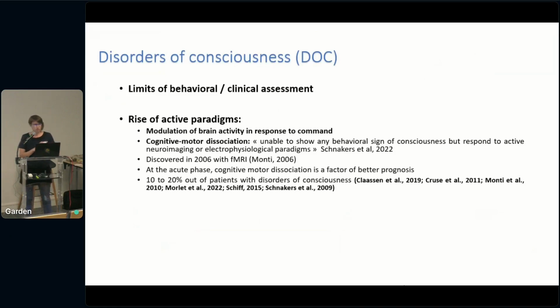You saw previously mostly passive paradigms, where brain activity is recorded and we ask nothing of the patient. But there are also active paradigms where you ask something of the patient, moving his hand, counting some sounds, and you record it, and you can see if there is a modulation specifically due to this command.